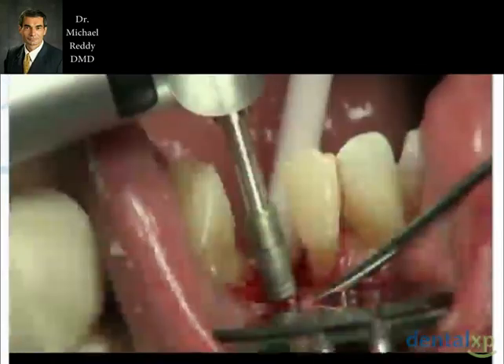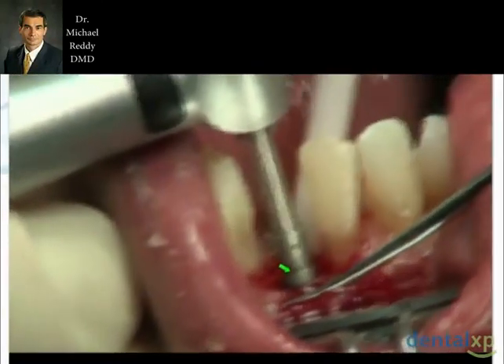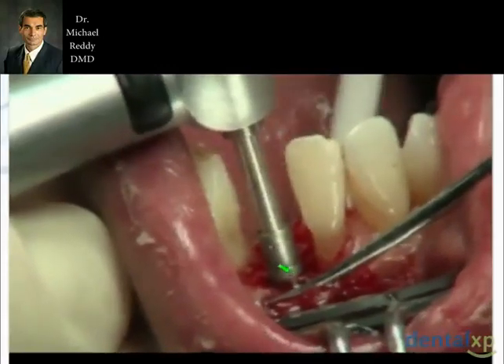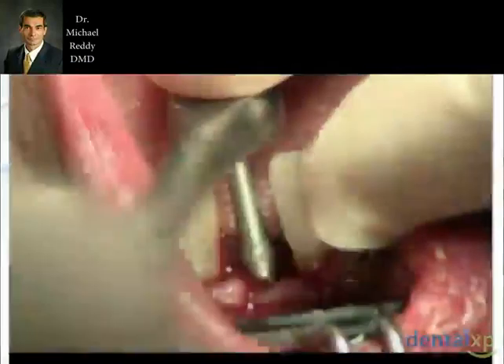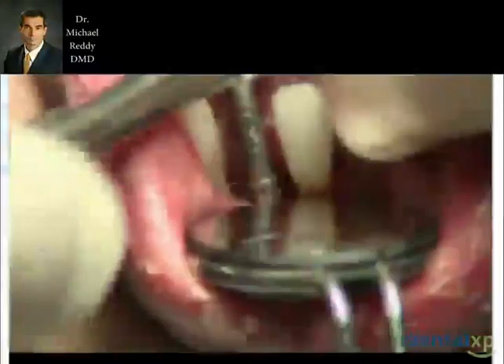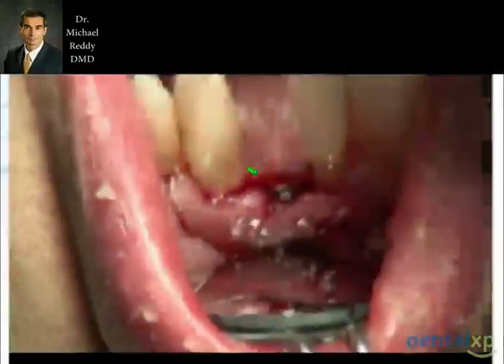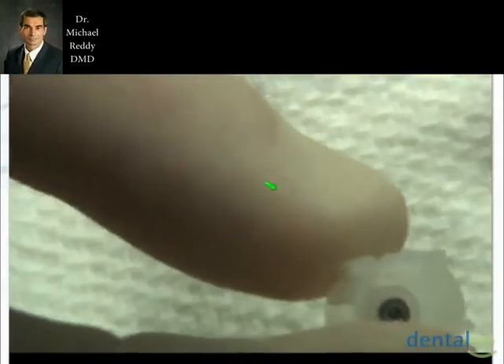We're coming down here, and you can see that we have this laser bladed surface right at the top, and we can go ahead and leave that at that point. Okay, then I'm going to just move this along just a little for you. We can use a ratchet at this point to go ahead and finish it, and you can see these dots that are on the ratchet that orient the hex so that we know where the position of the hex is.